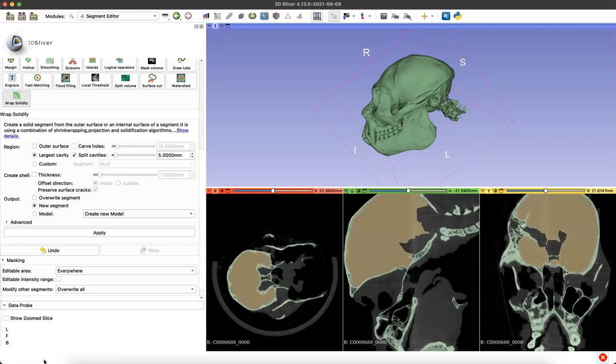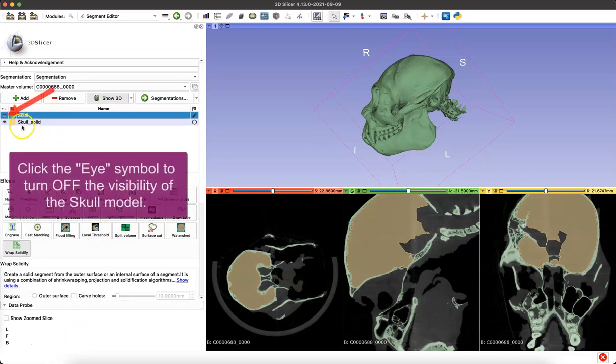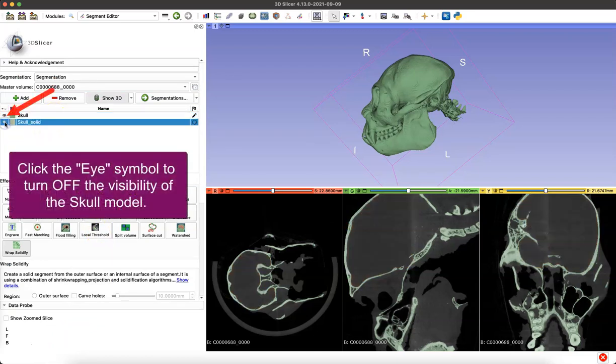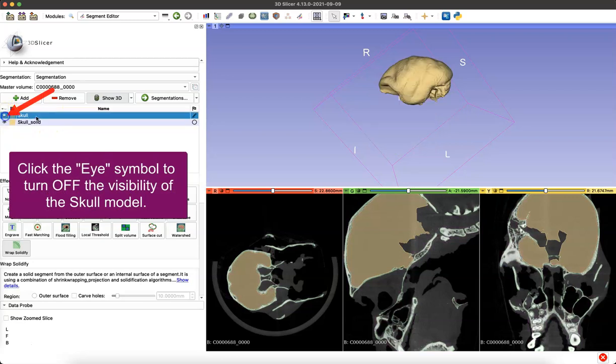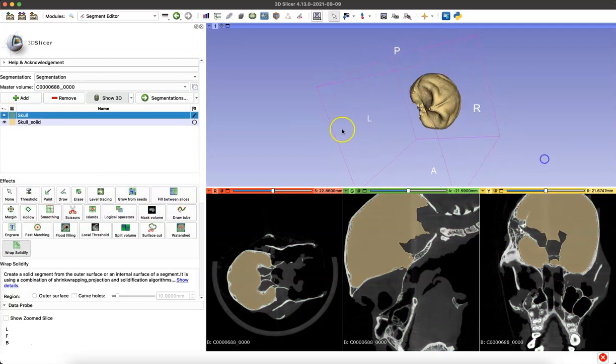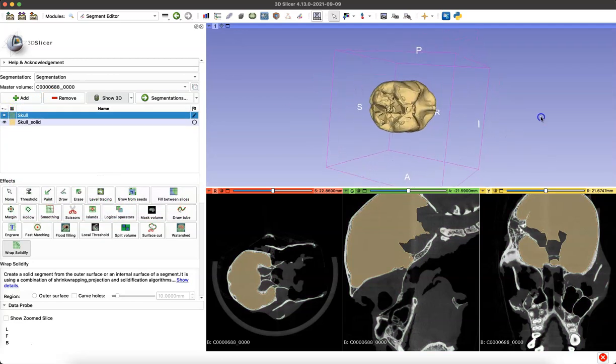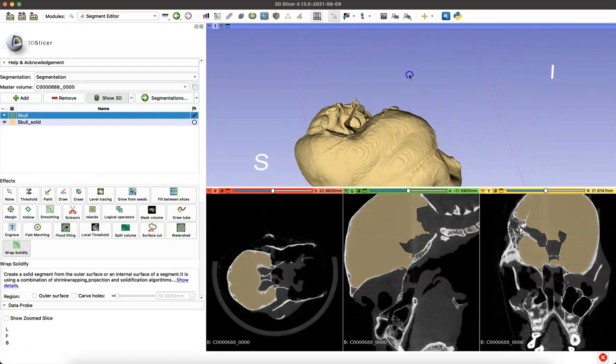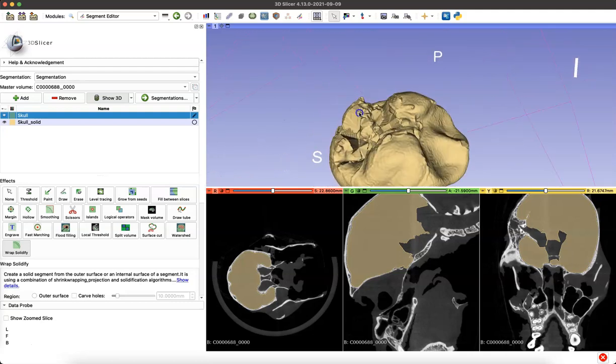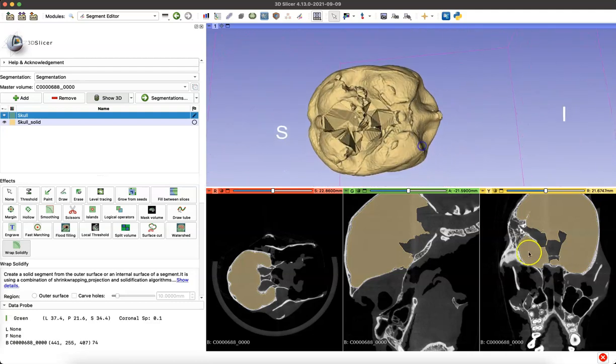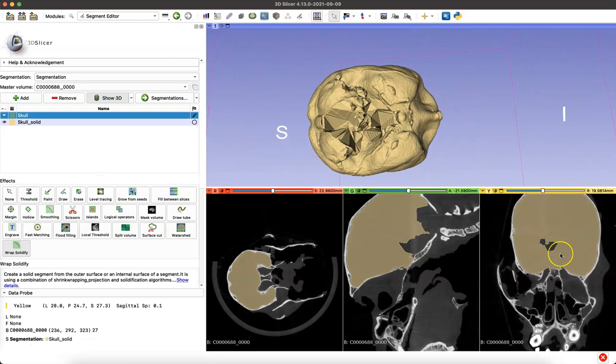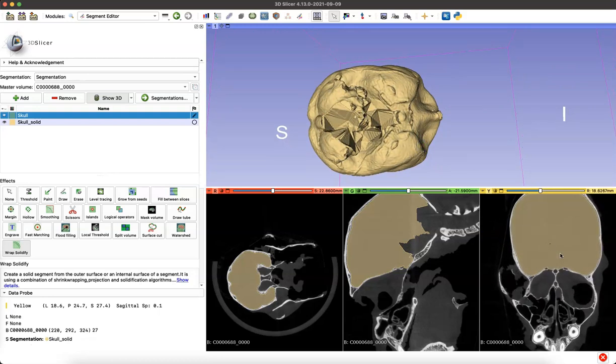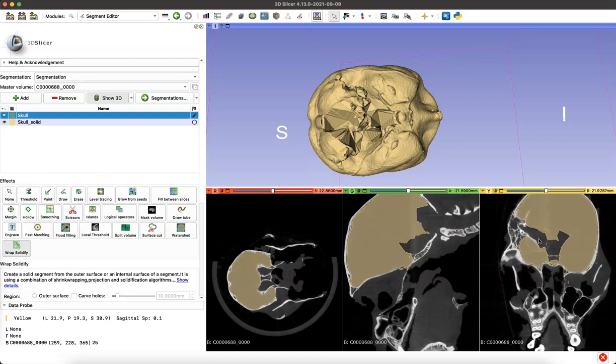Our endocast has appeared. And as you can see, it didn't completely fill the cranium. So I wanted to include this so that we can troubleshoot together. First off, I'm just going to turn off the visibility of the skull model so I can just see the model we just created of the endocast. If I rotate it in 3D space, you can see that data that's missing in the bottom of our model. And if you scroll through the slices, you can also see that empty space that wasn't captured by the program.